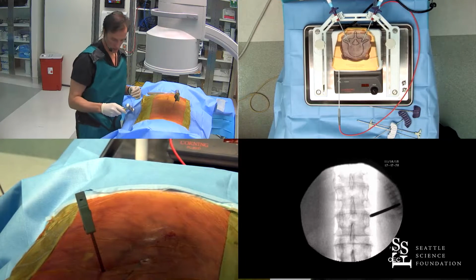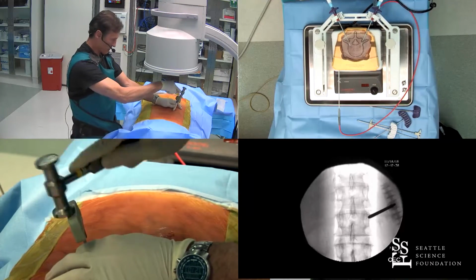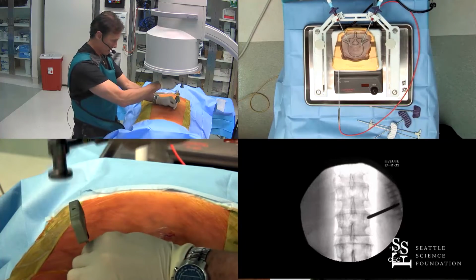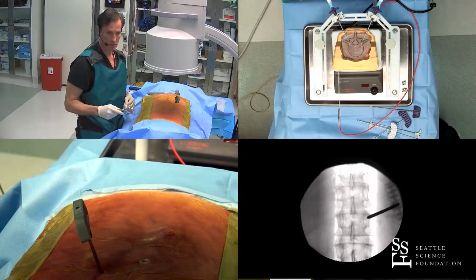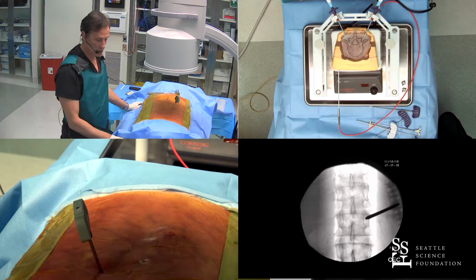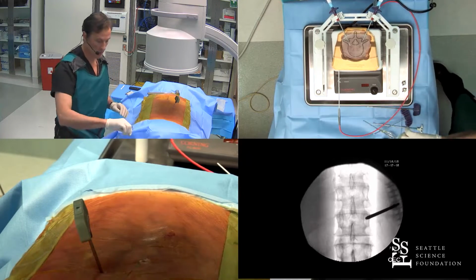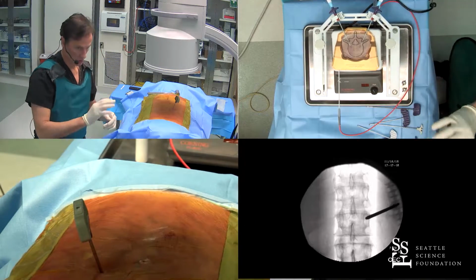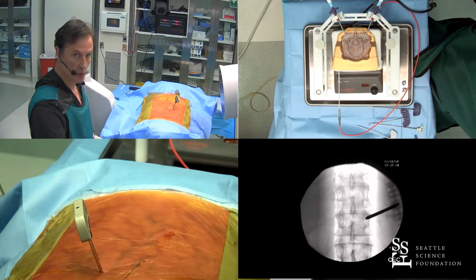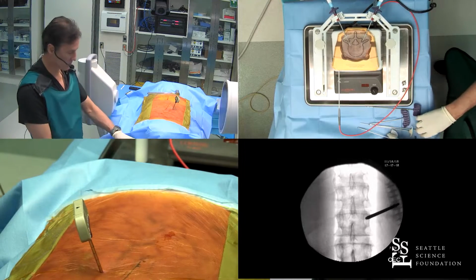The face of the needle is facing opposite me, and we're driving the needle in this transpedicular approach. And we will drive it down to the pedicle. Before we transgress the medial wall of that pedicle, we're going to look lateral, to make sure we're in the posterior portion of the vertebral body.